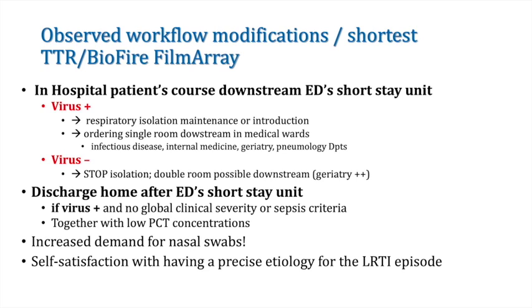On the contrary, for virus-negative patients, we could stop isolation. We could propose the patient a double room. It was particularly useful in geriatrics, where single rooms were not so frequent.